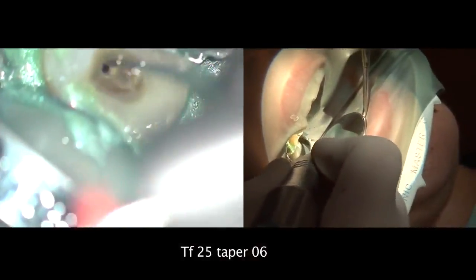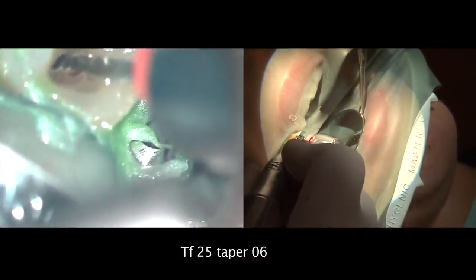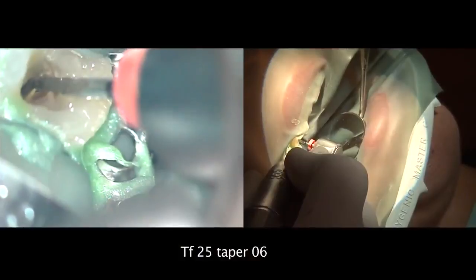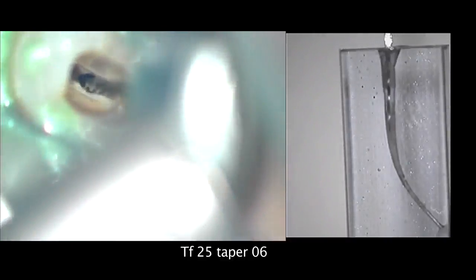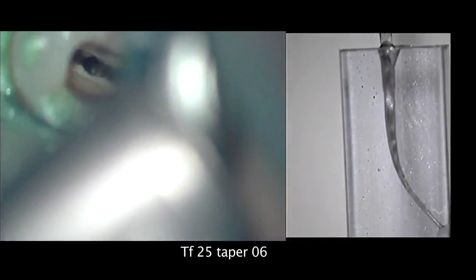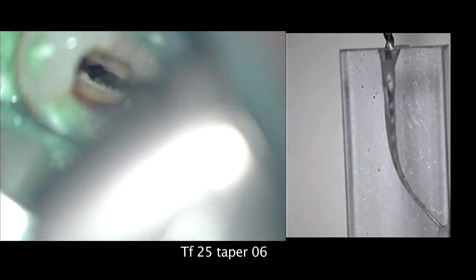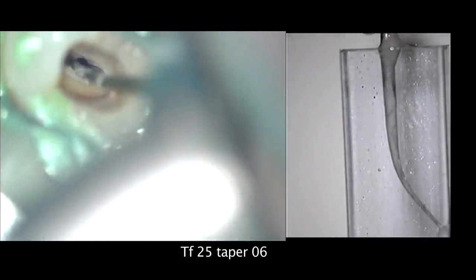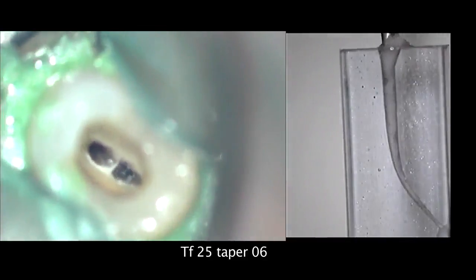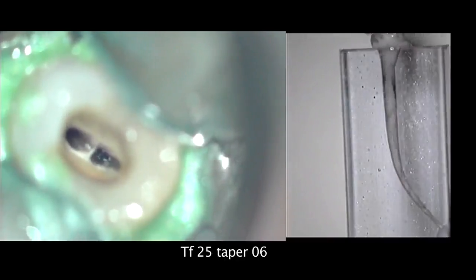The next step is to use 25-06 to reach the apical area and working length. Again, it's going to be four gentle strokes in the buccal and palatal canal. You can see on the slow motion how the 25-06 is going inside the root canal — working, cutting, and taking the debris out of the root canal system. The macro cannula is then used to clean this area in both canals.